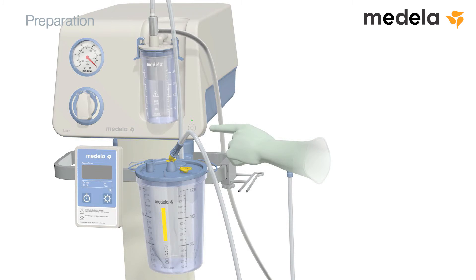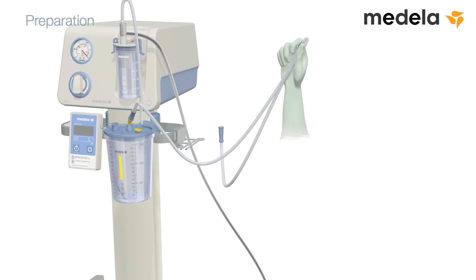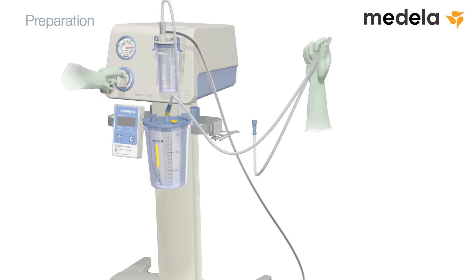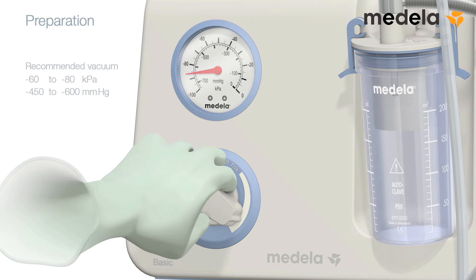To test the vacuum, turn on the pump and clamp the sterile tubing with your thumb and forefinger. Fully depress the foot-controlled vacuum regulator by pressing forward and down using the ball of your foot. Set the pump to the required maximum vacuum.